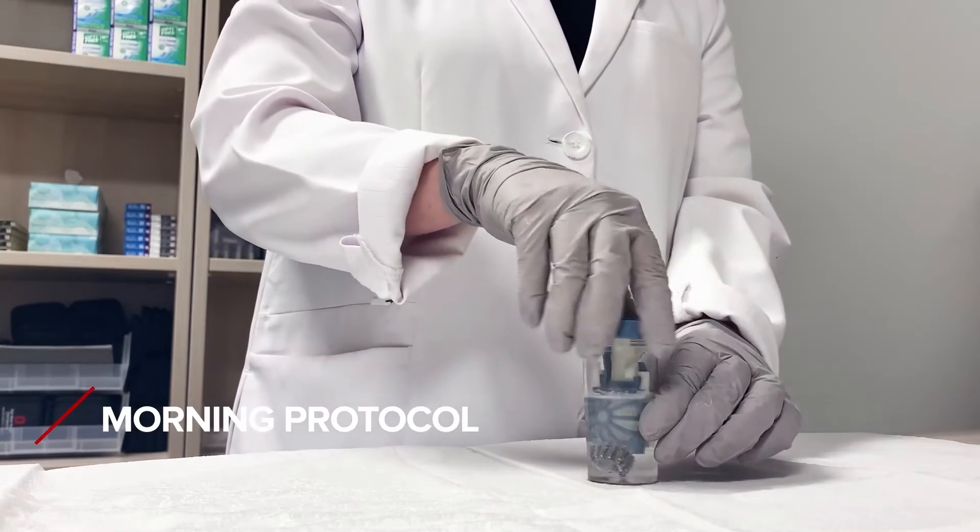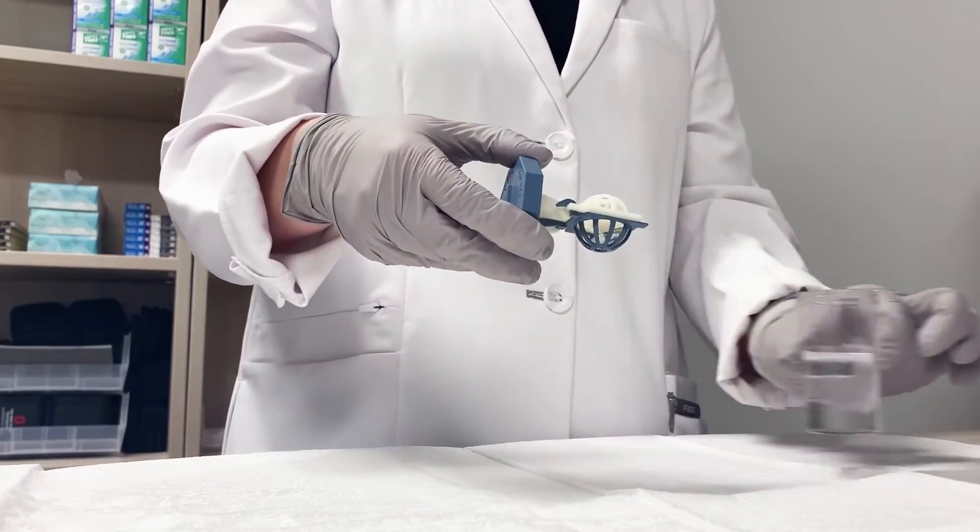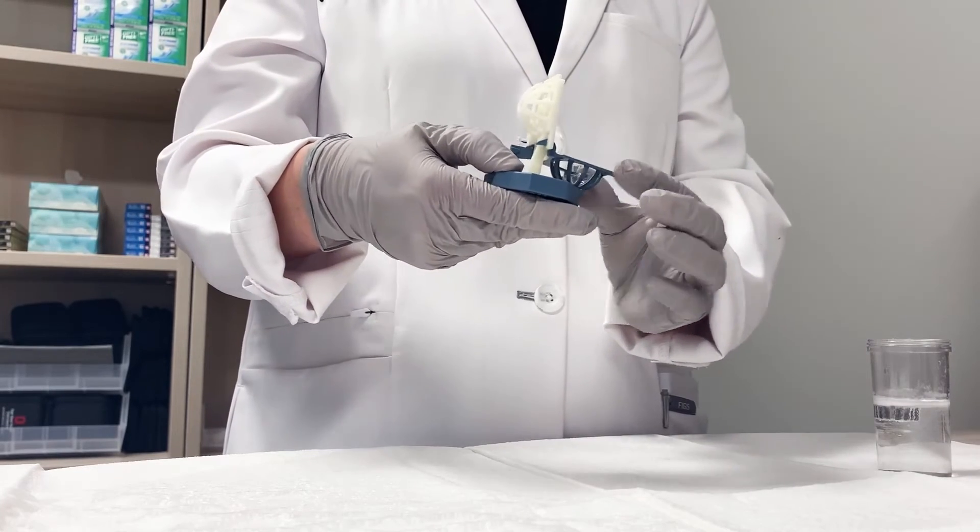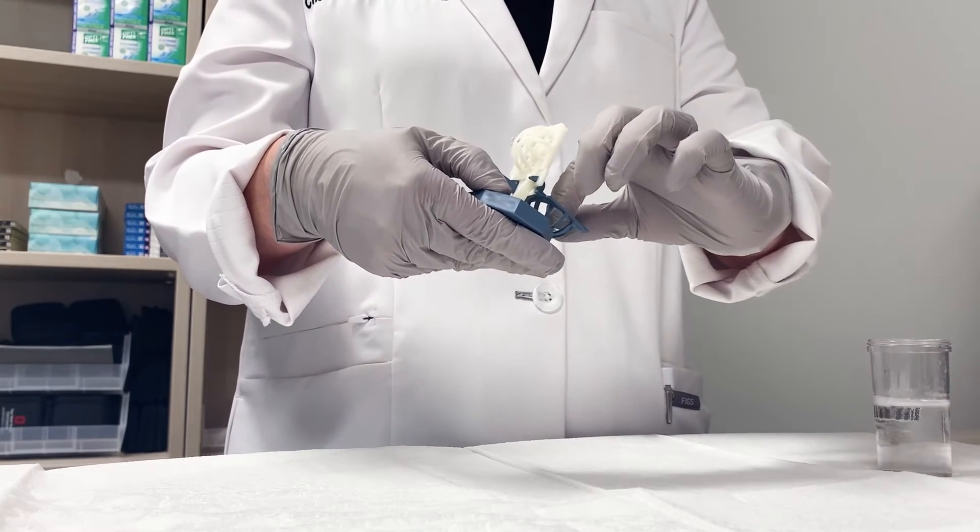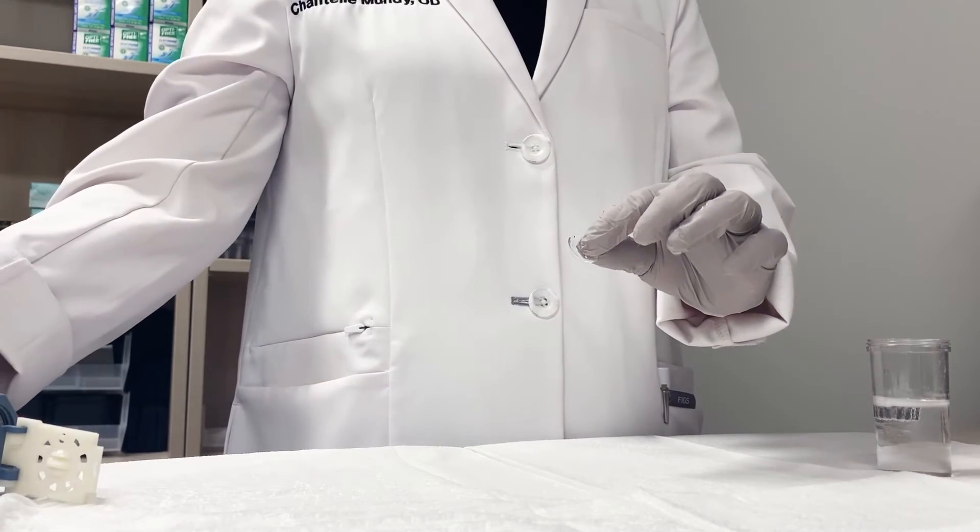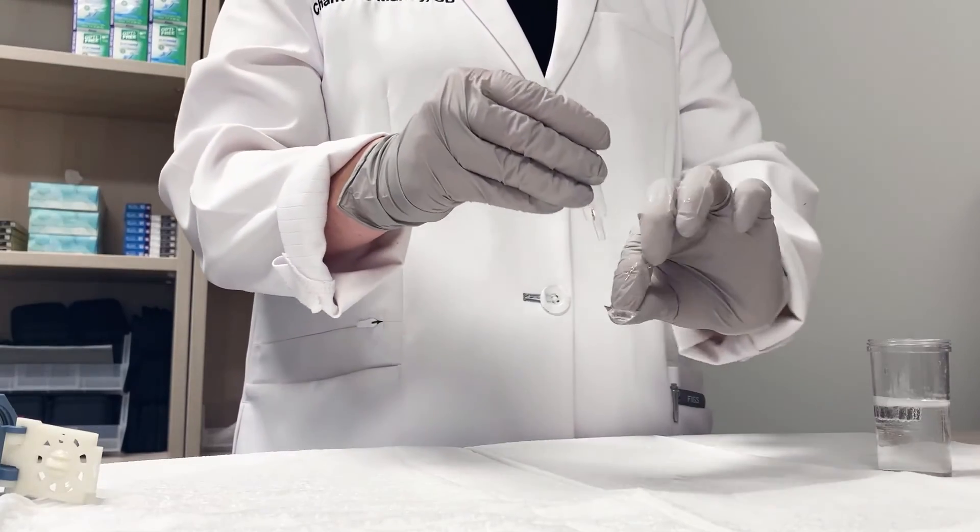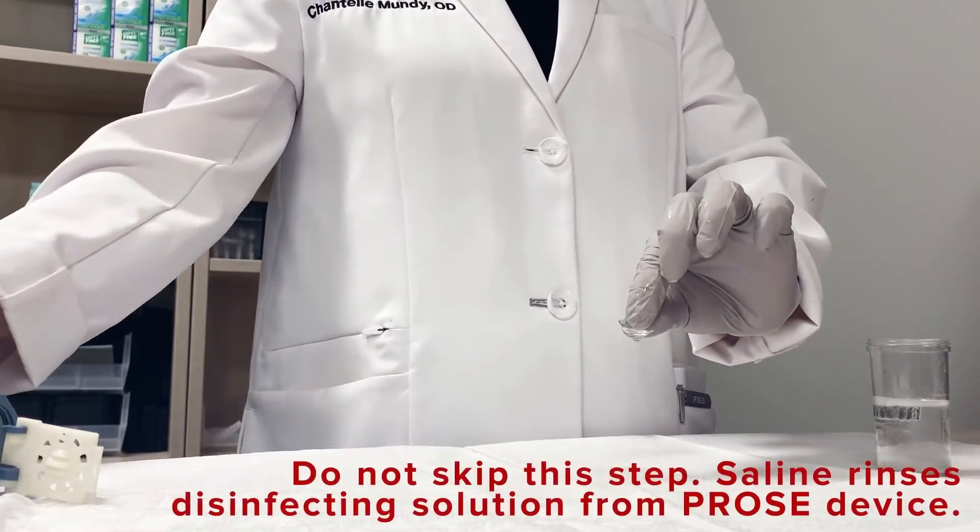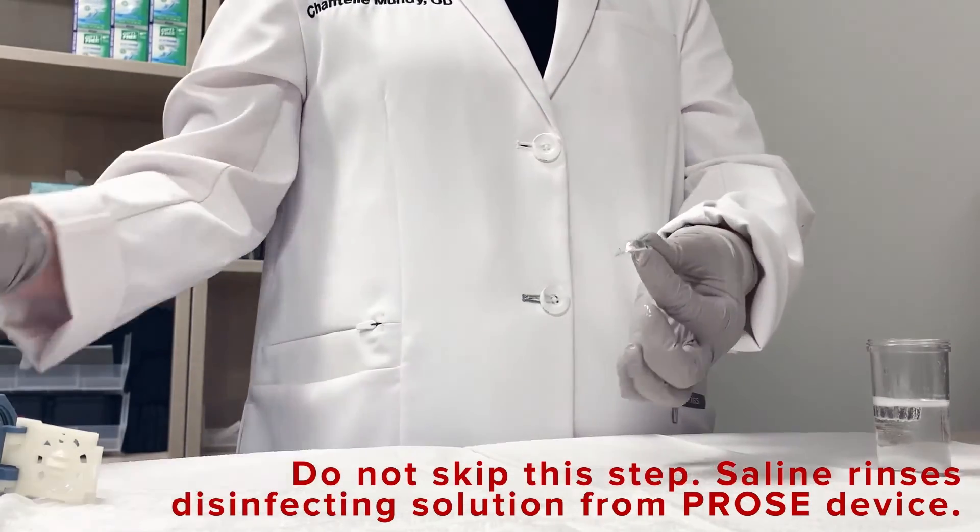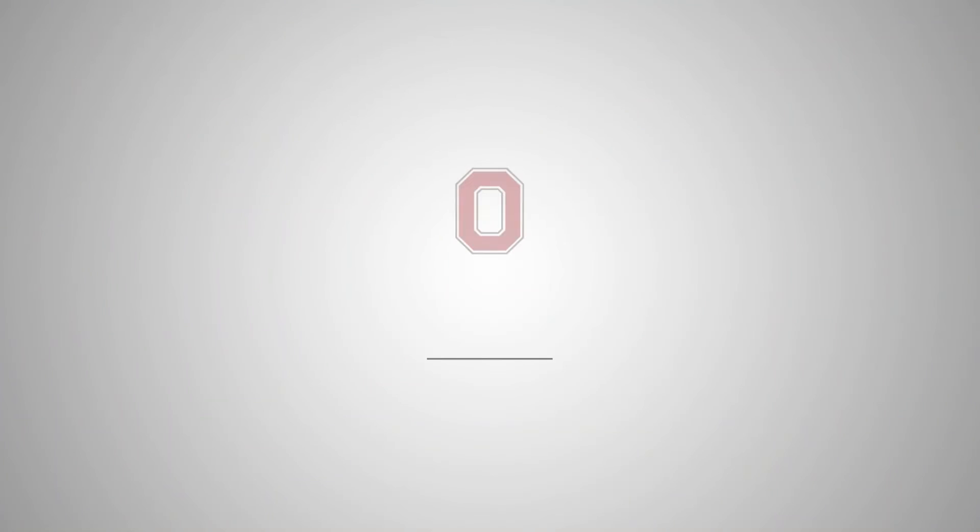To remove, open the basket gently and handle the device by the edge. You are then going to use the non-preserved saline solution prescribed by your doctor to rinse the lens. Your device is then ready to be applied to the eye.